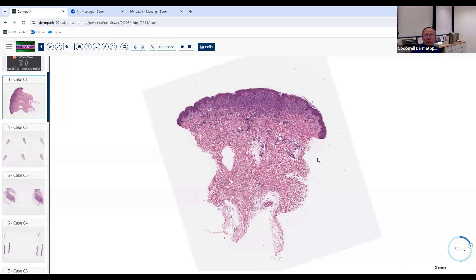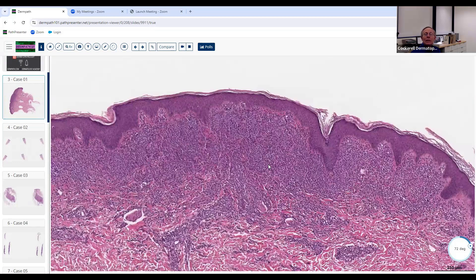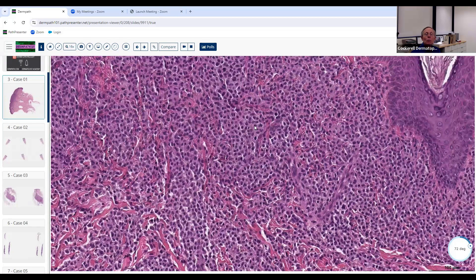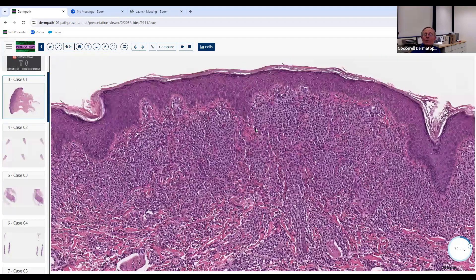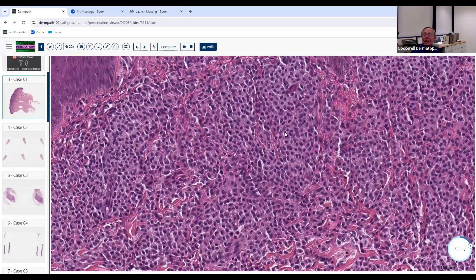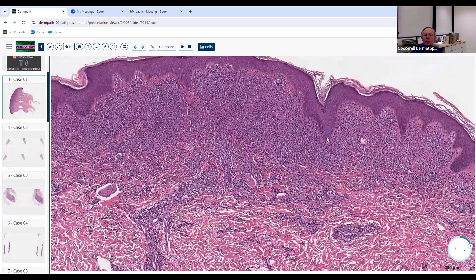Here we've got a punch biopsy, probably taken from the trunk or proximal extremity. At low power, there's an infiltrate of cells that don't look jet black like lymphocytes — they look sort of purple. Lymphocytes at low magnification really look black, even though at higher magnification they're dark purple. So we're not sure: is it inflammatory or neoplastic? They certainly don't look like typical classic inflammatory cells.